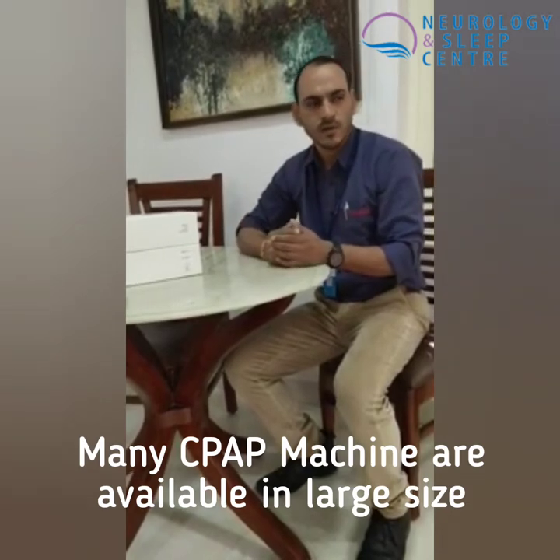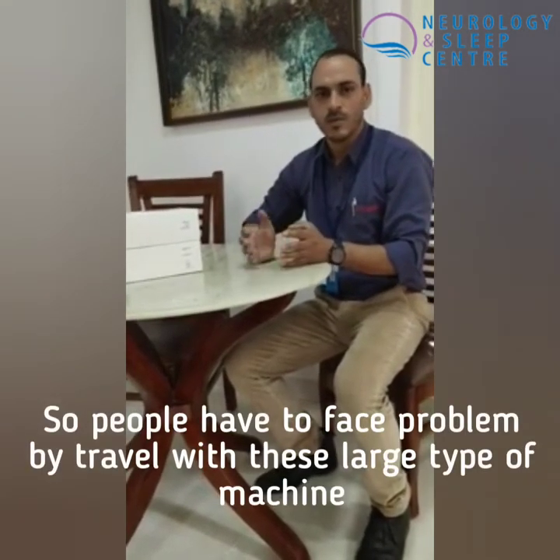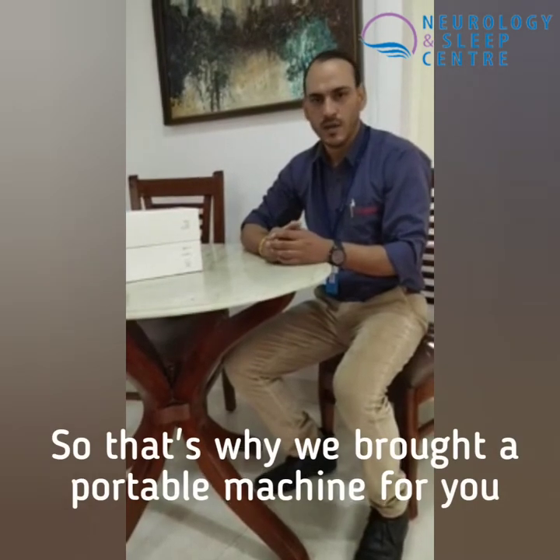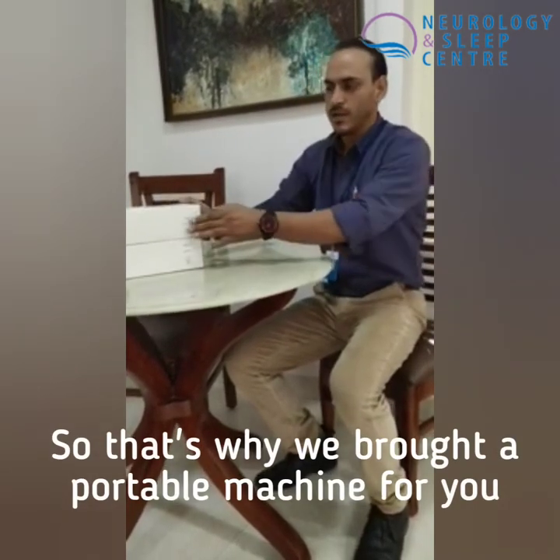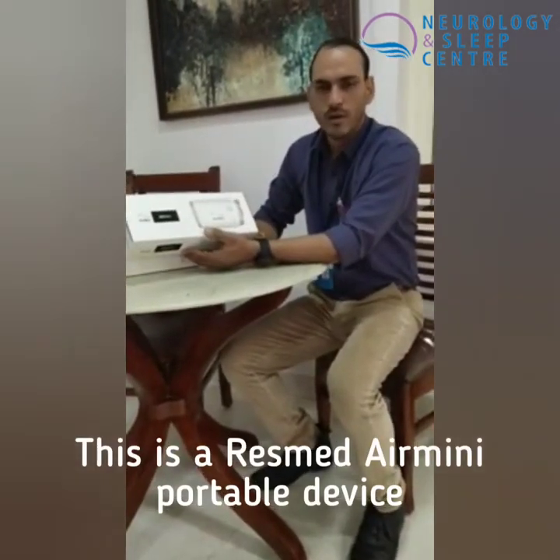Basically, CPAP machines come in large sizes, so people have a lot of concerns when it comes to travel. So we have a portable machine, which is made by a company, and it is a portable device.